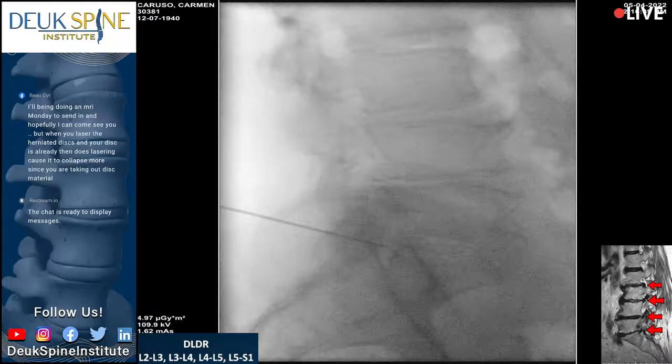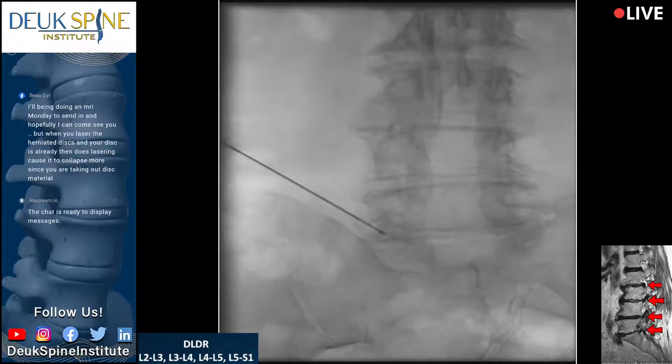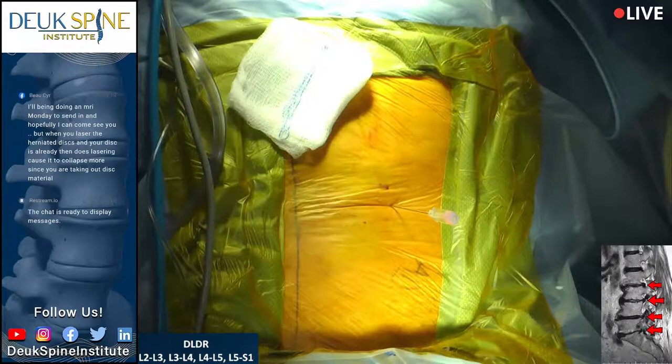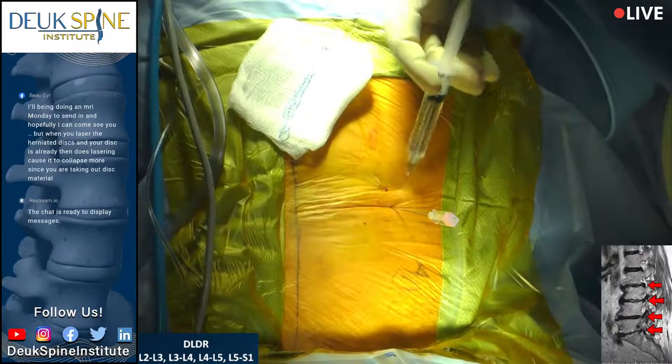This is going to be the hardest disc for us to get to and fix, the one that's going to be the most difficult. I mean, we're like perfect on AP and lateral. All right, I'm going to go for L4-5. I'm going to wait. Yeah. I'm going to give him a few more minutes. I'm going to come back to this one. I'm going to start L4-5. Let me just give him a little more numbing medicine. Yeah, because he has a very narrow window. Understood.